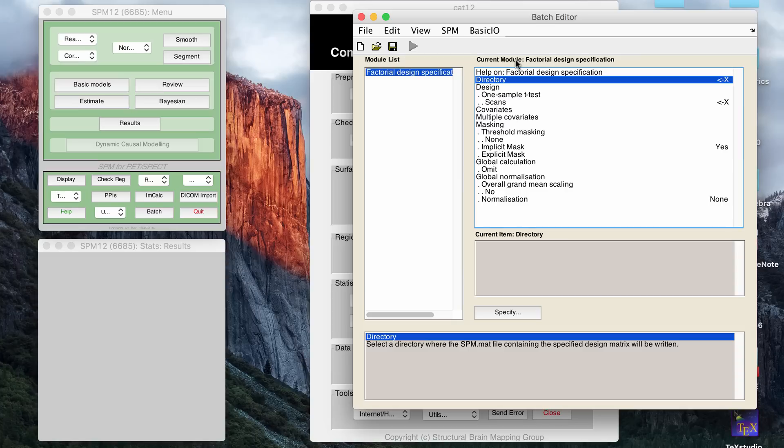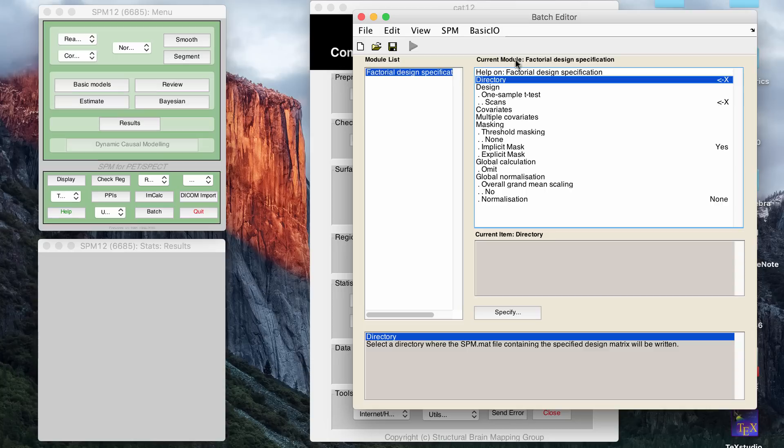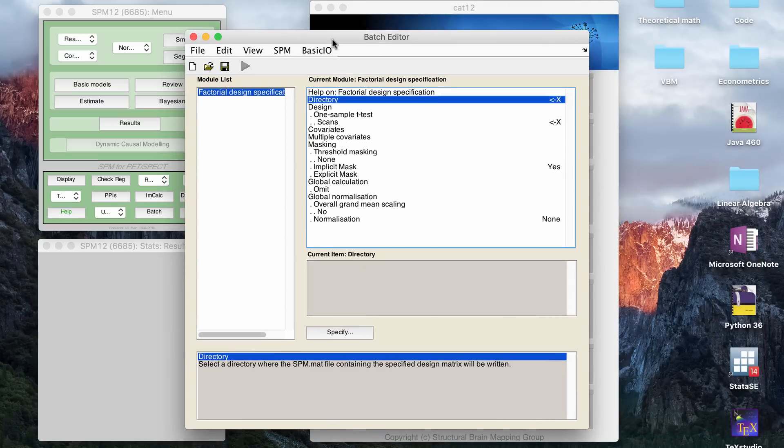But if you're comparing, for example, a group of patients versus a group of controls, you might want to do a more advanced test than just a t-test. You can do f-tests on here, and it really depends on how you want to do the study design.